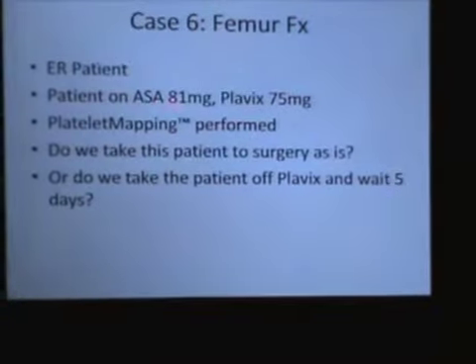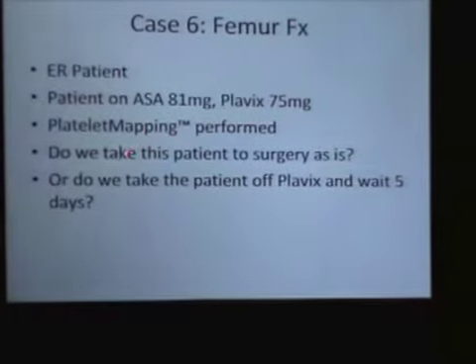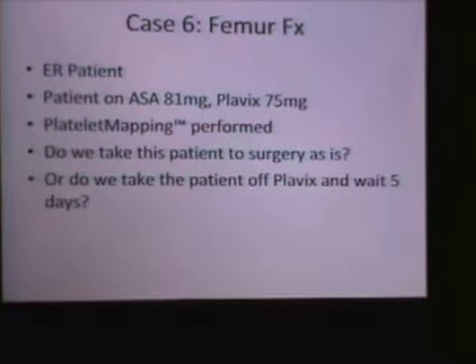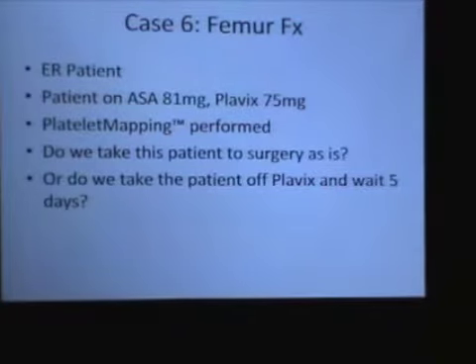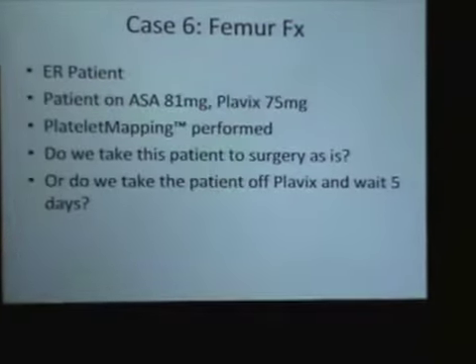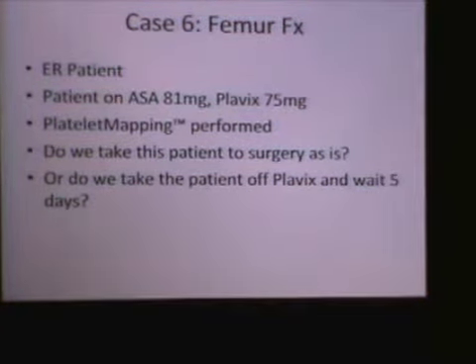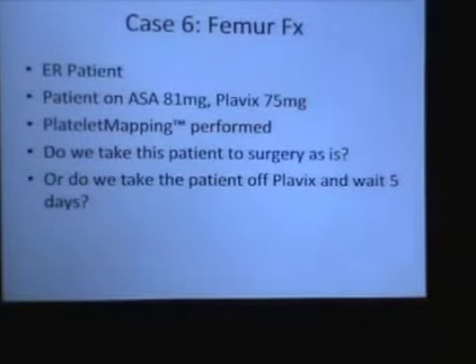Okay, femur fracture. Patient on 81 of aspirin, 75 of Plavix. Do we take this patient to surgery? Do they go to surgery right away, aspirin and Plavix patient? We have to wait for 7 days. Right, 5 to 7 days wait, right? Okay, so what do you do? You put them up in the hospital for 7 days, keep them in traction, right, and wait for the drugs to wear off?